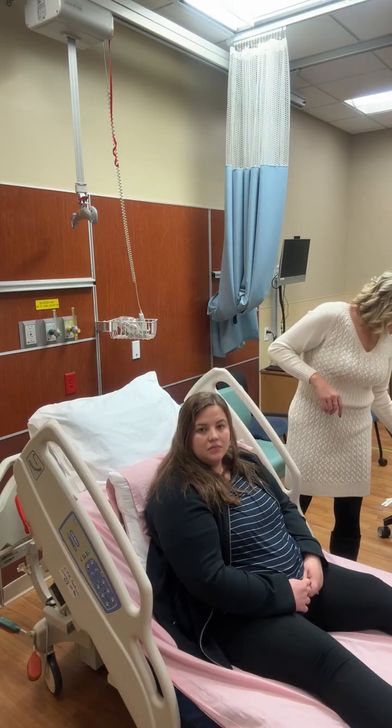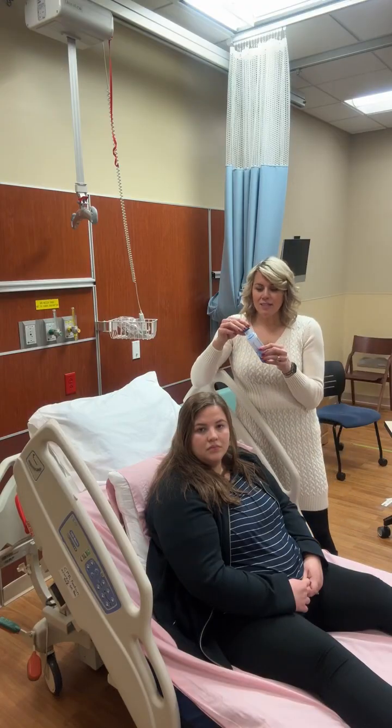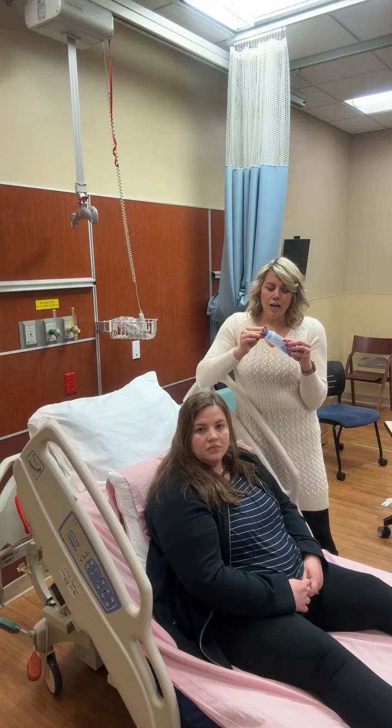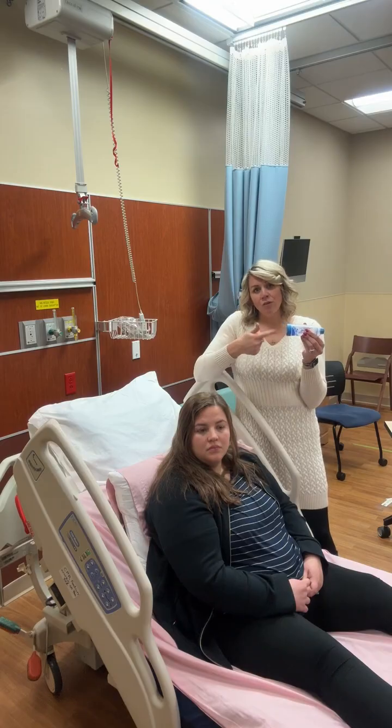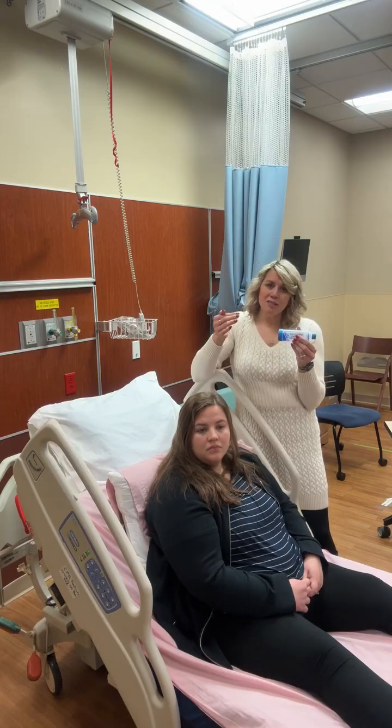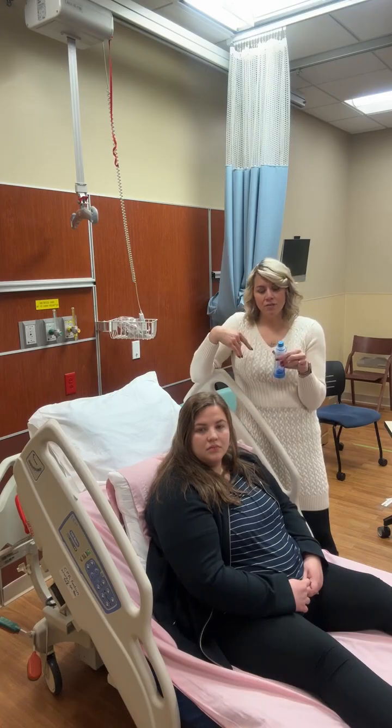As far as this spacer is concerned, this is obviously Ashley's spacer. So we always tell people to rinse them out with hot water and just let them air dry. Don't clean it out with any rags or paper towels, because then those little particles can come off inside there, and then the patients can actually breathe that in. So we don't want them to do that.